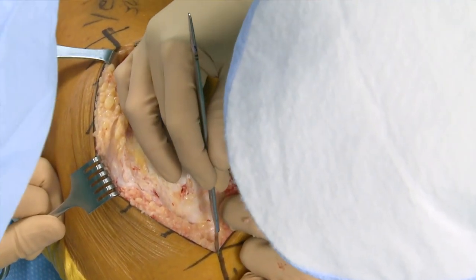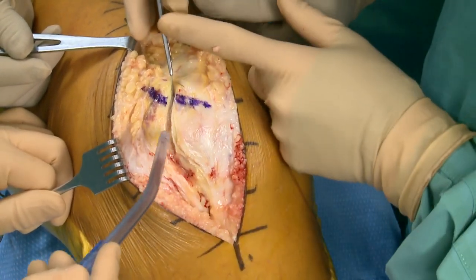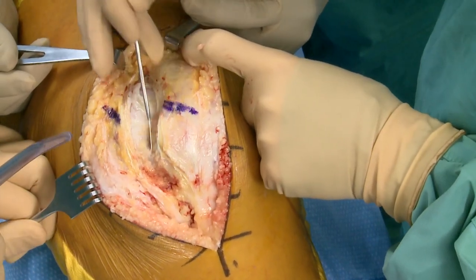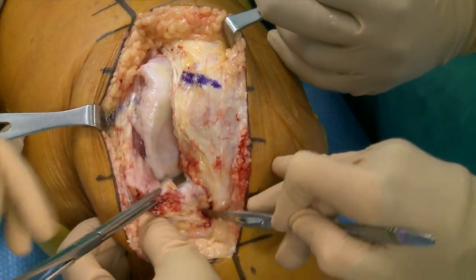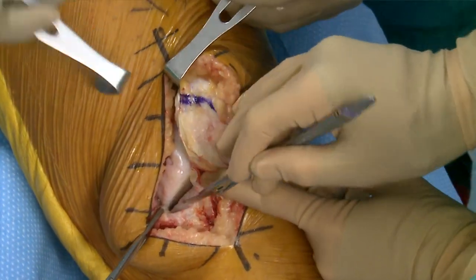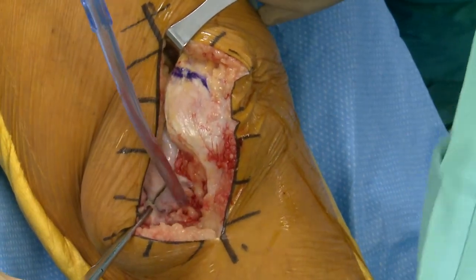I don't do any sub-vastus or mid-vastus approach — I've pretty much always been a medial parapatellar approach. The image is great. For this varus knee, going around the medial side is going to help from a soft tissue standpoint, but this will be my opening approach for every knee, even a valgus knee, because I want to expose the medial side enough that I know I'm protecting the MCL.